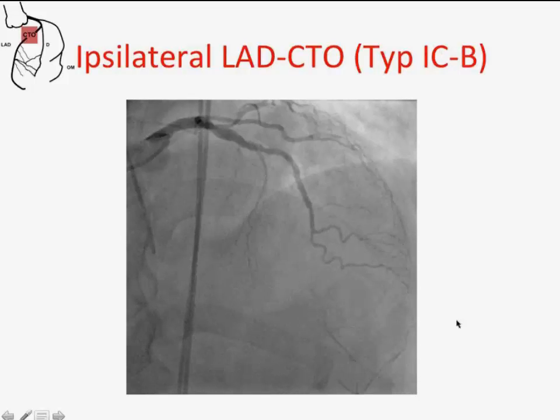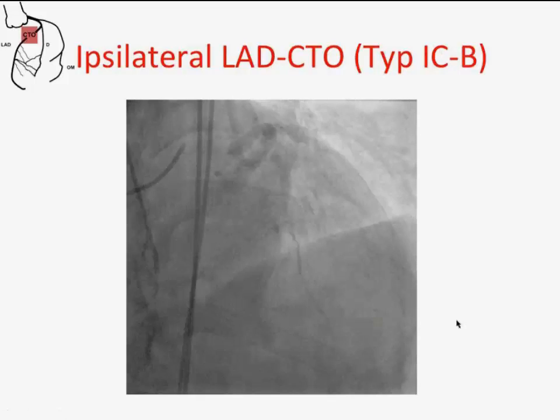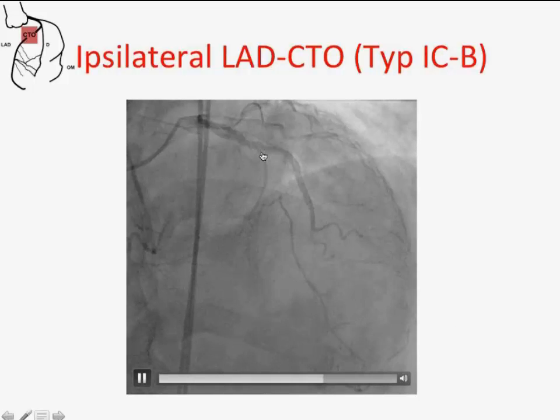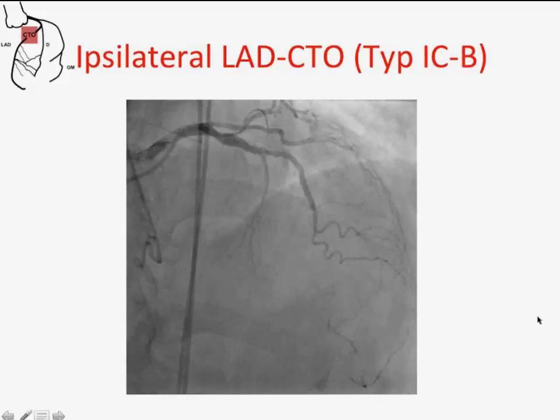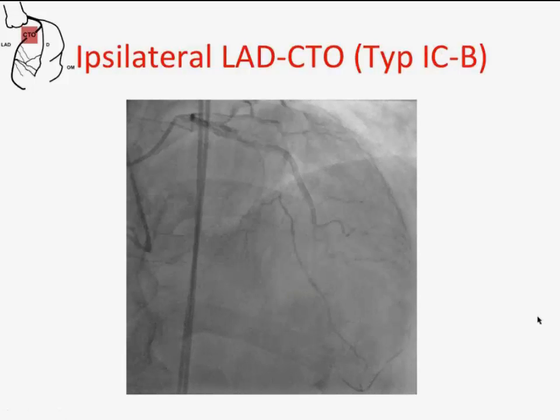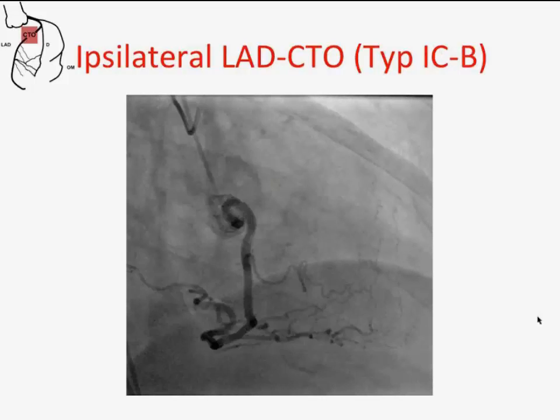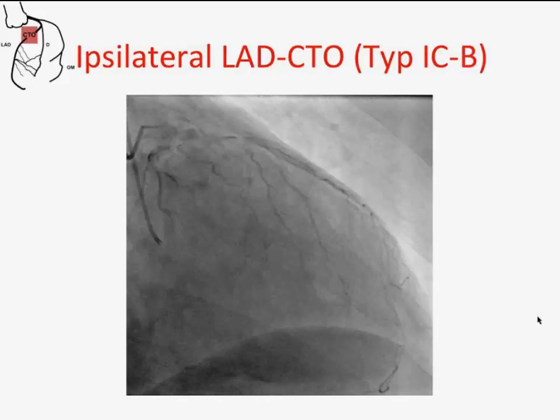The patient had a non-ST elevation myocardial infarction, and the doctor stented the diagonal. He overstented the LAD but didn't realize this, and the patient came back 2 years later saying he wasn't feeling good. We also checked the right and saw some epicardial and some septal collateral connections.